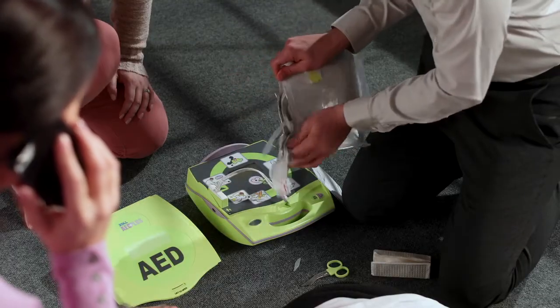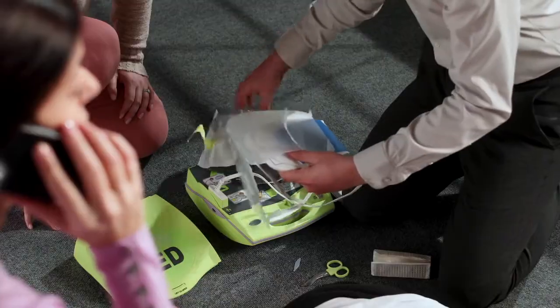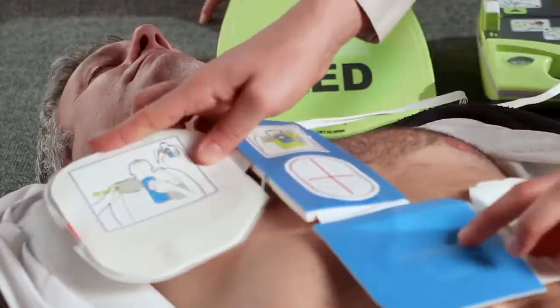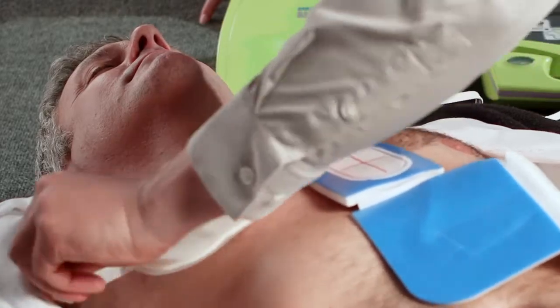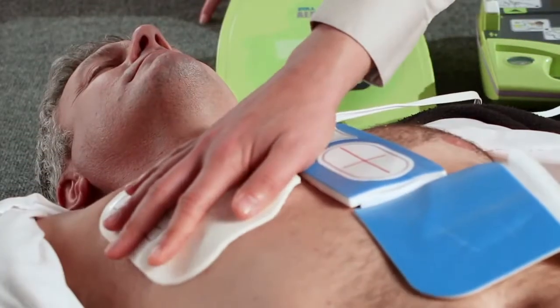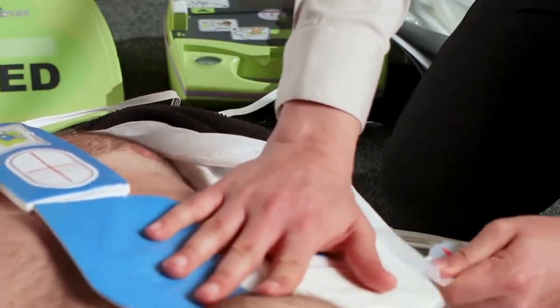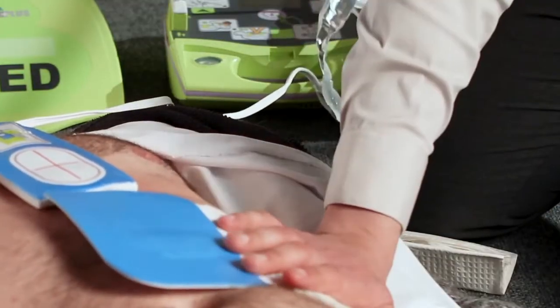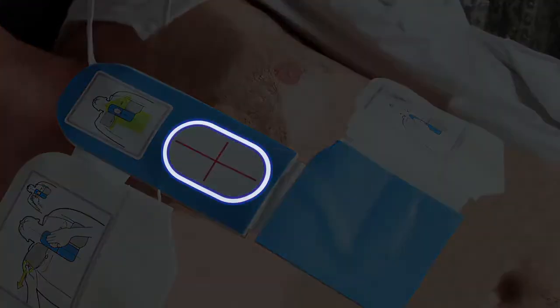Zoll's one-piece CPR-D pads are designed for fast and accurate placement. Peel-and-place design helps prevent pad damage and mishandling. The CPR-D pads have a CPR sensor built-in that provides feedback to the rescuer on CPR compression quality. The landmark also supports proper CPR hand placement.